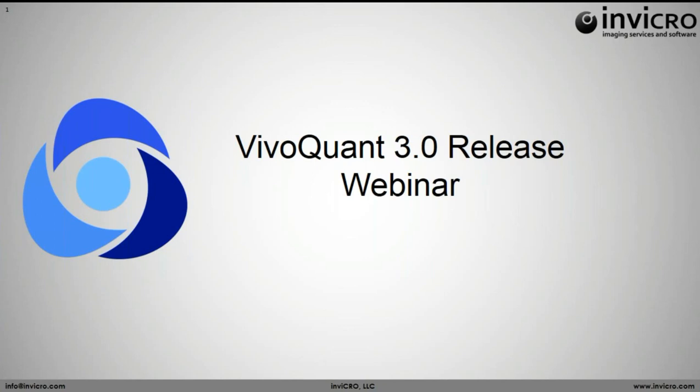I'm a software account manager for InVicro, and today I'll be going through the very exciting and much anticipated release of VivoQuant version 3.0. A little outline and background before we get started.